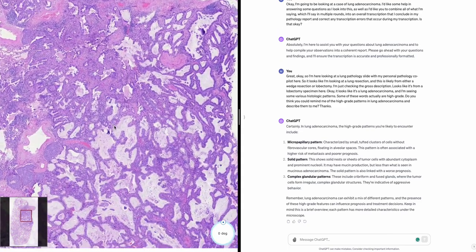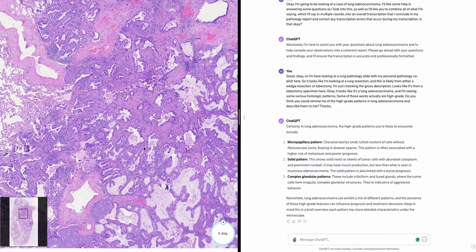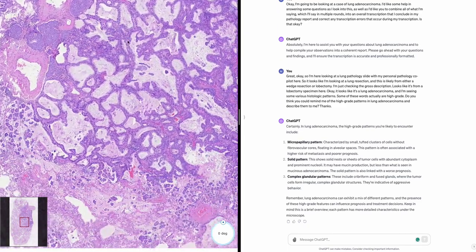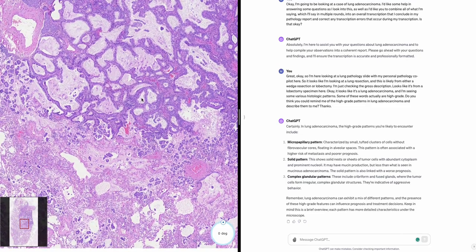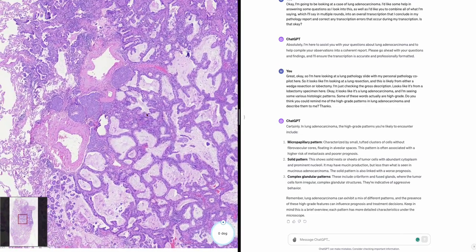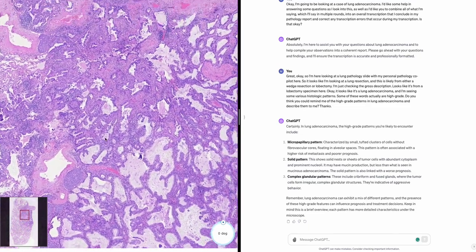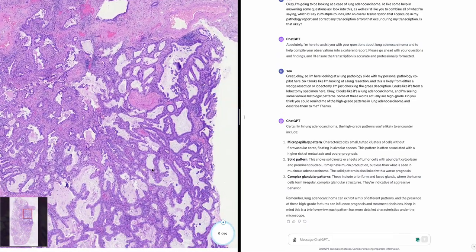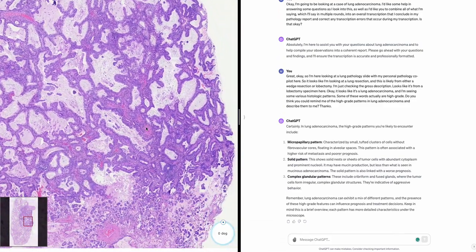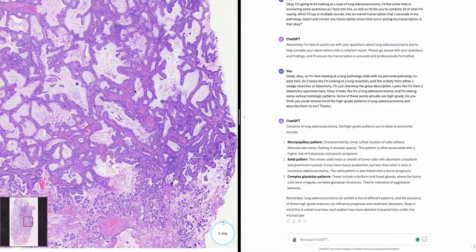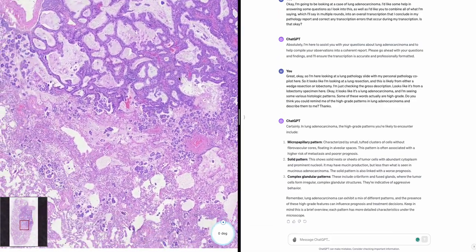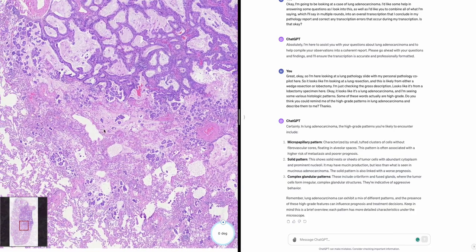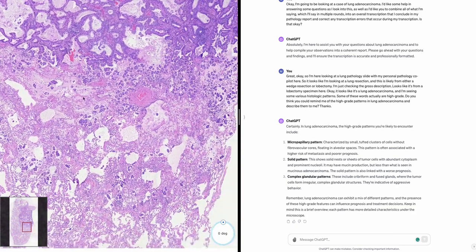Looking at the slide, I think there's just over 20 percent — let's say 25% — of a mixture of high-grade patterns including micropapillary, solid types, and maybe a bit of a fused glandular pattern. However, the predominant pattern is an acinar component, a subset of which has mucinous cells.